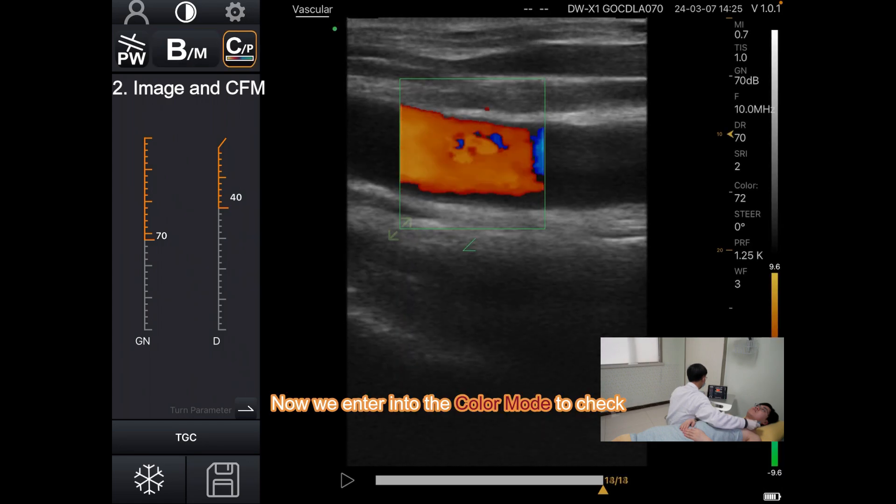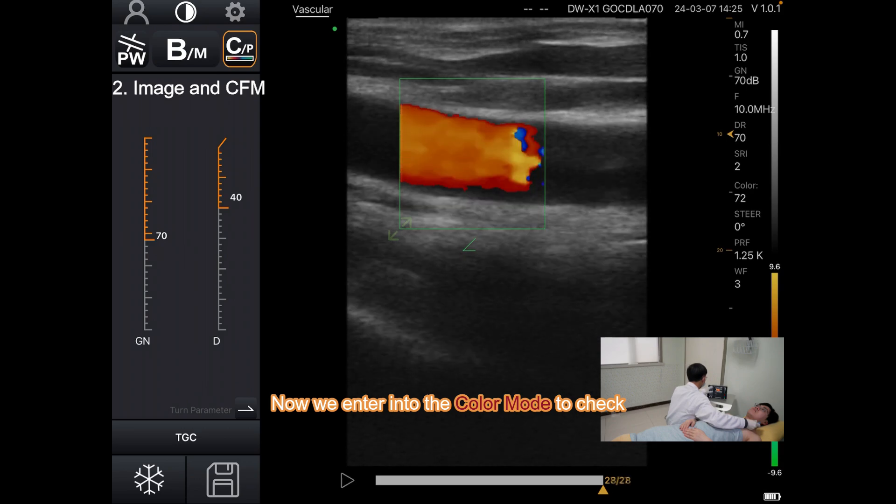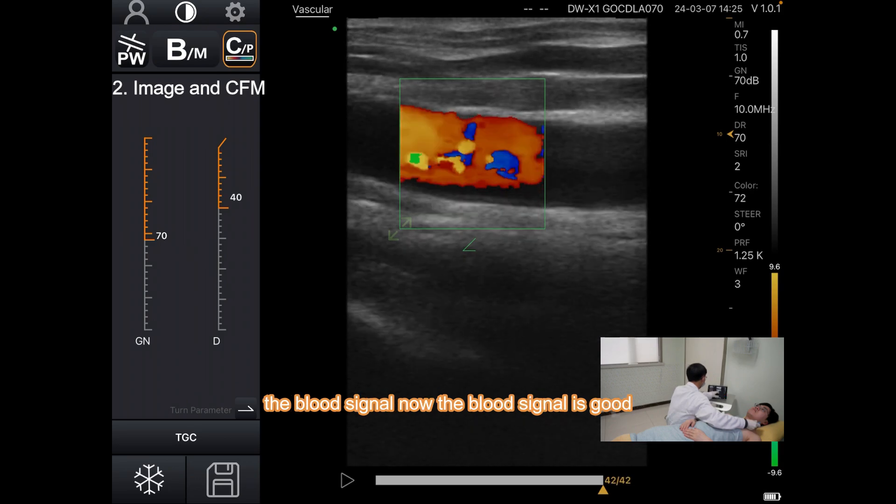Now we enter into the color mode to check the blood signal. The blood signal is good.